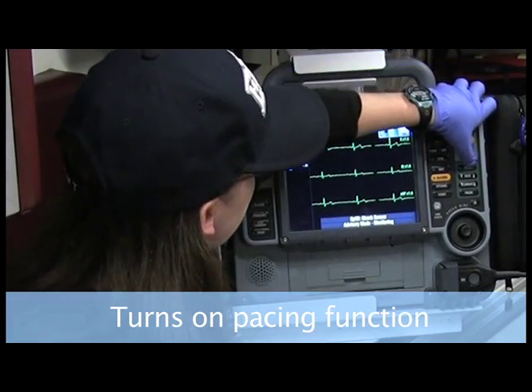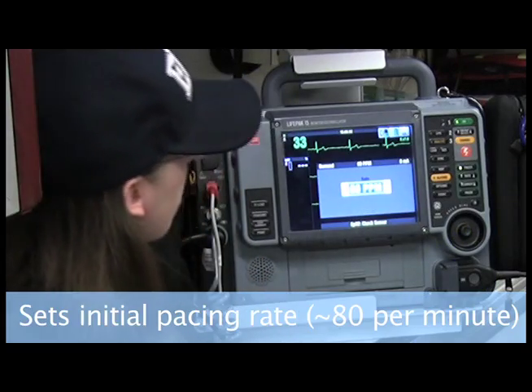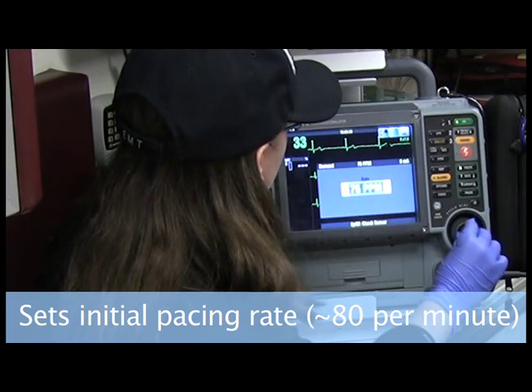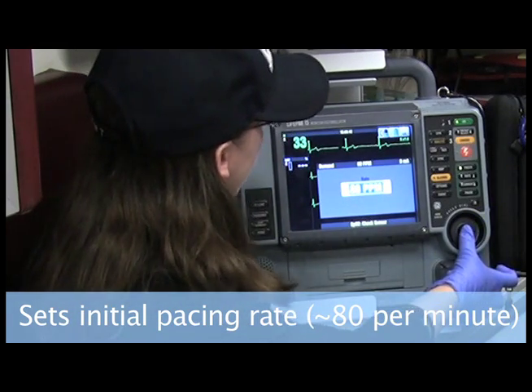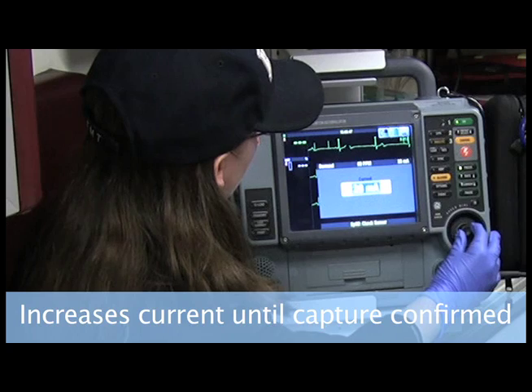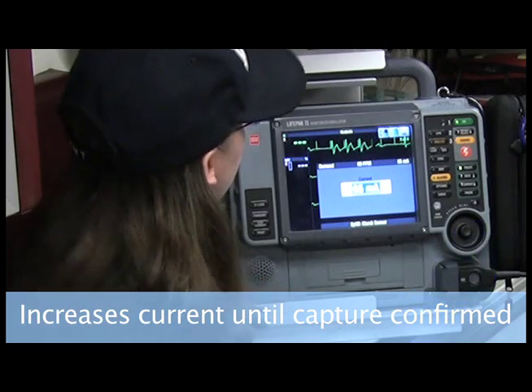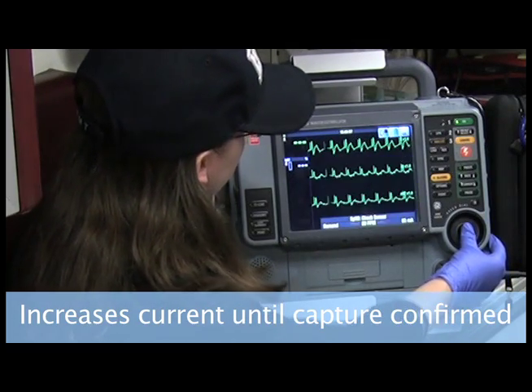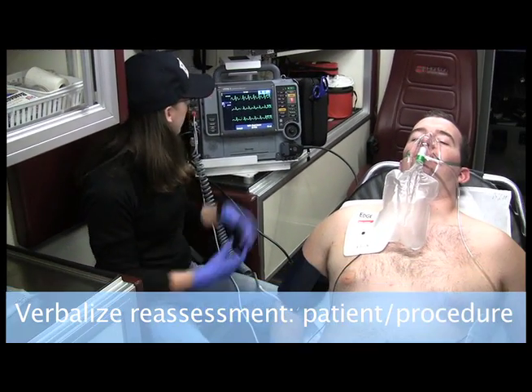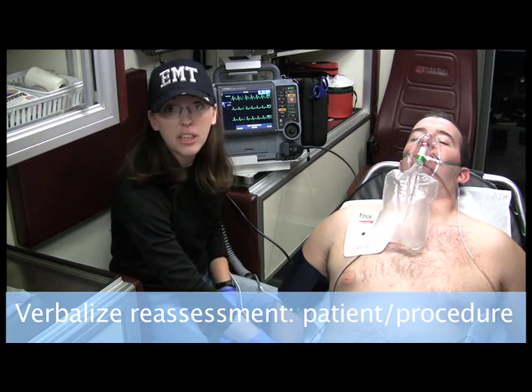So I'm going to go straight to pacer, entering manual mode. Now, the rate for my protocol that I follow is 80 beats per minute, so I have the rate set at 80. And for the current, I continue going up until I see capture. I see the spikes — okay, so now that I have capture, I hit that.